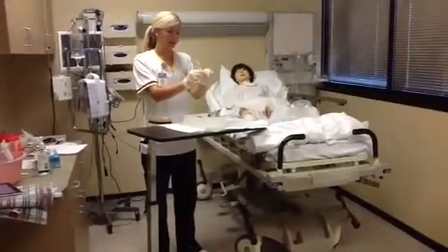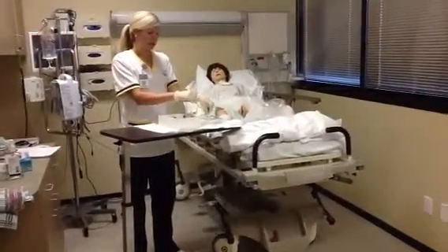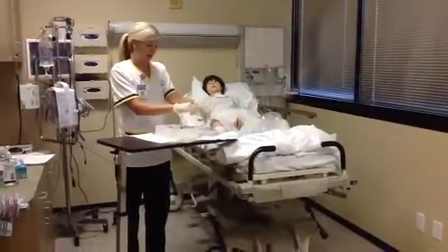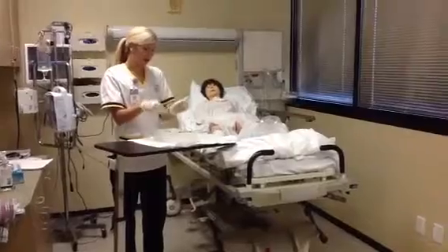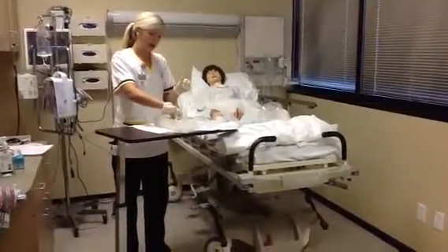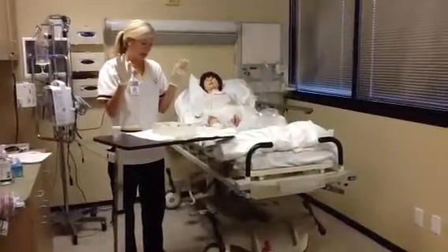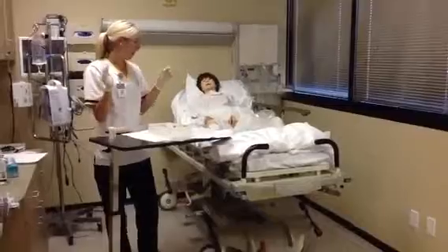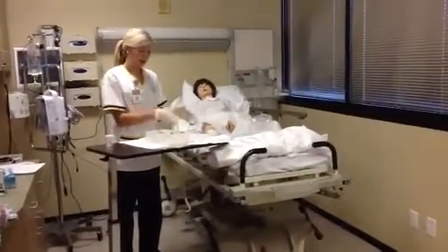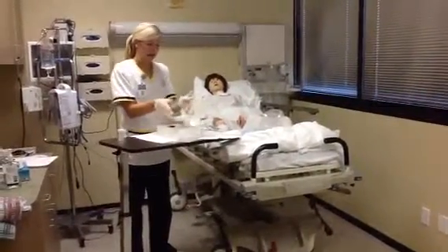Okay, I'm then going to take this and lube it up in my lube, and I'm going to place it back in the box. I also noticed that there is this medicine cap that I do not need, so I'm going to leave this over here. And again, my hands are never going below my waist, never turning my back to either sterile field. But now that I am complete over here, I'm going to go ahead and place this back on here.